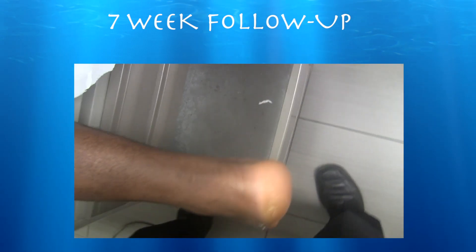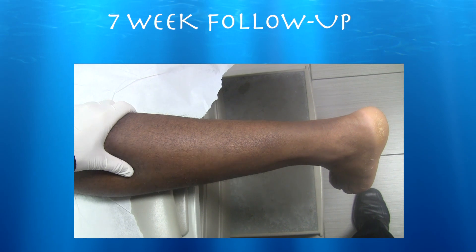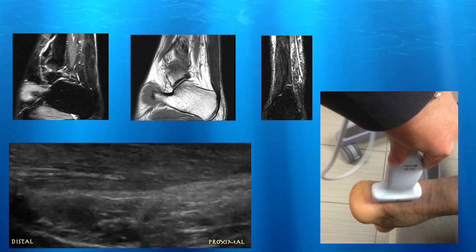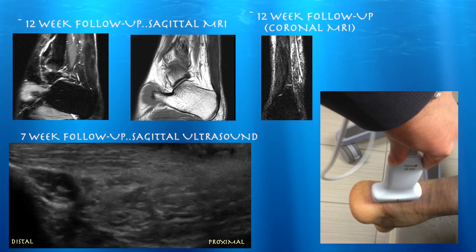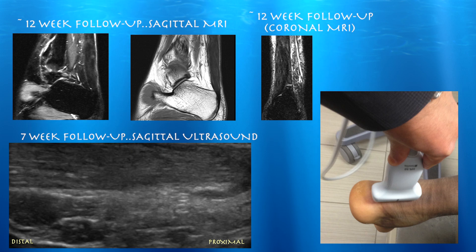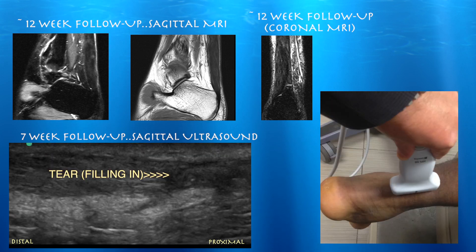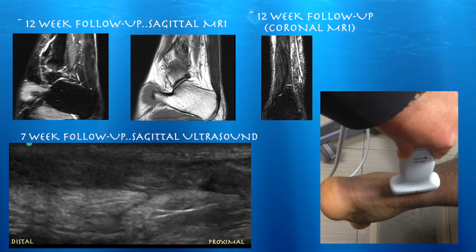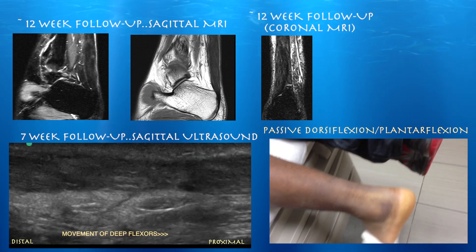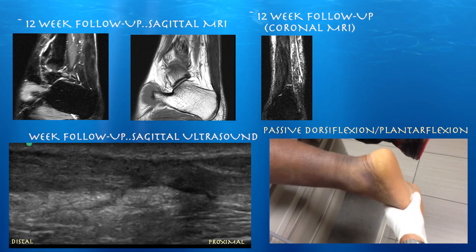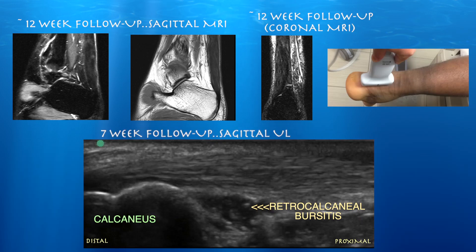Let's do our Thompson test here — and it's connected. Here are some follow-up MRIs where you can see the thickening and irregularity of the Achilles tendon consistent with healing. Here's our follow-up ultrasound, which is consistent with the MRI findings. With some motion you can actually see movement of the deep flexors of the foot. Still some scarring is keeping that Achilles tendon somewhat tacked down, and it still shows some retrocalcaneal bursitis seven weeks out from the injury.